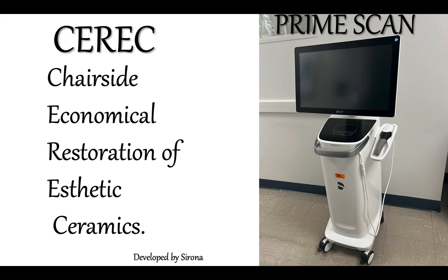However, over the years, dentists started to expect that labs also help them with the milling, and not necessarily the dentist doing it immediately at the same time that they are scanning.